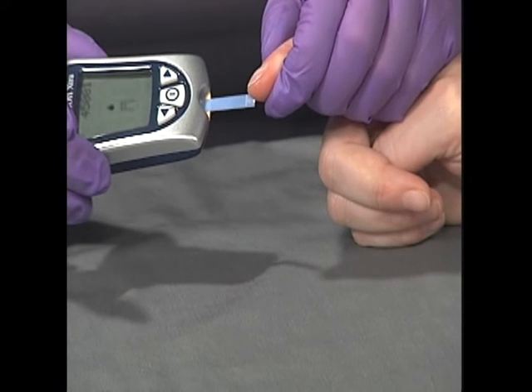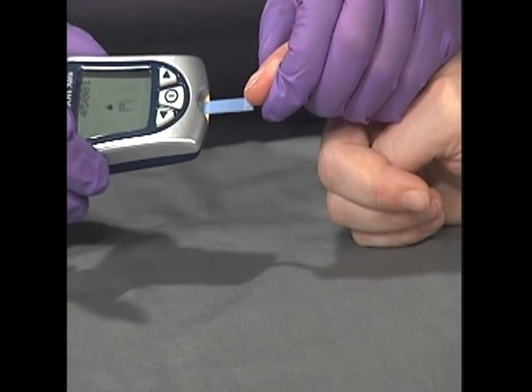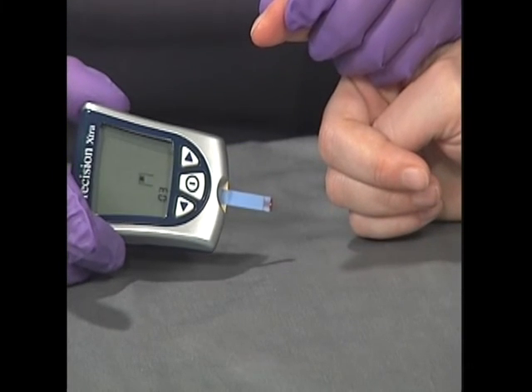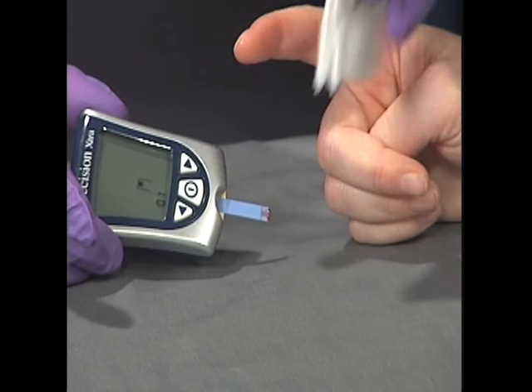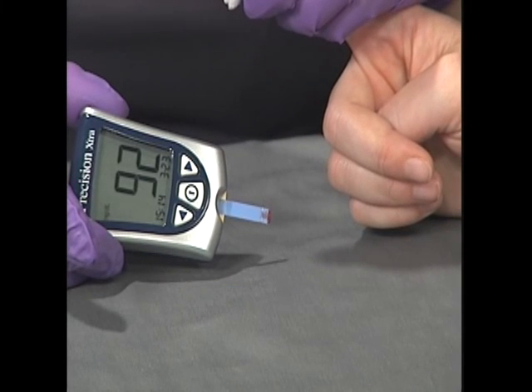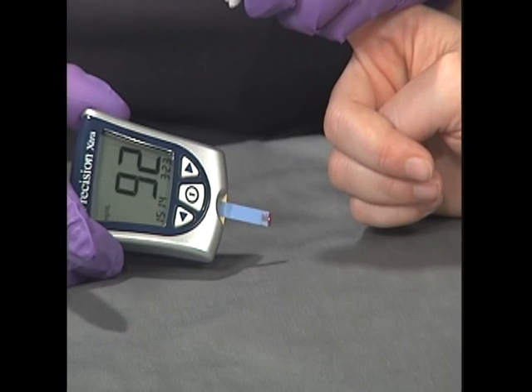Apply the blood to the test strip. Many units have a countdown and will give you a reading in a few seconds. When the measurement is completed, record it as milligrams per deciliter. Cover the puncture site with a band-aid if bleeding continues.